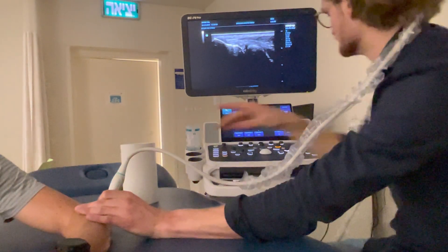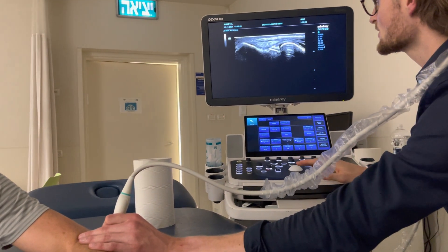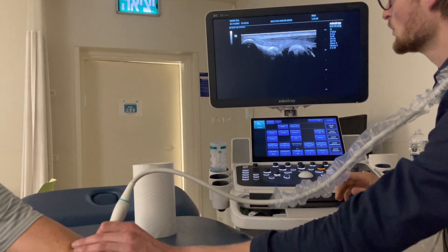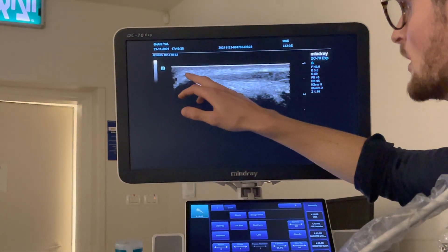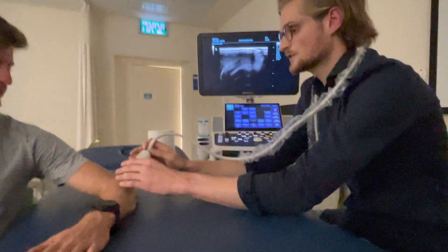I don't see a clear image of the radial head because I'm above the radial head, and this is the extensor carpi radialis brevis — this is the longus. If I go from this position more towards the shoulder, I will lose totally the whole lateral epicondyle and move into the supra-epicondylar ridge. So I come from the common extensor tendon position, I move up — this is a perfect example of the brevis — I move up and I immediately lose the total lateral epicondyle. Now I'm on the ridge above the lateral epicondyle. That would be the long axis view. Now let's go for the short axis view.